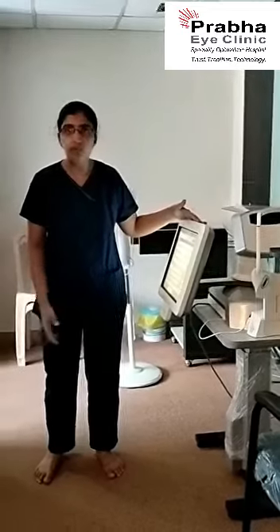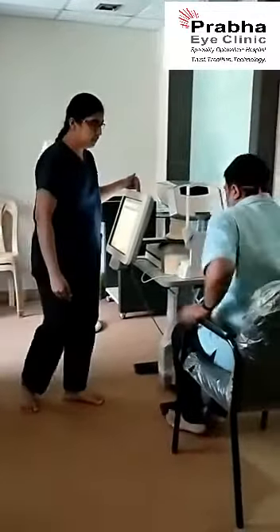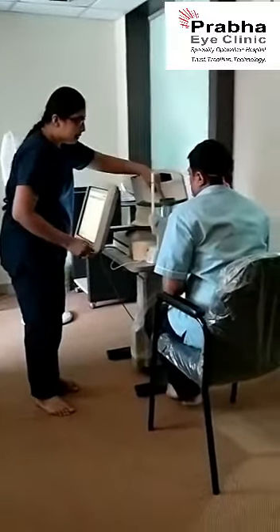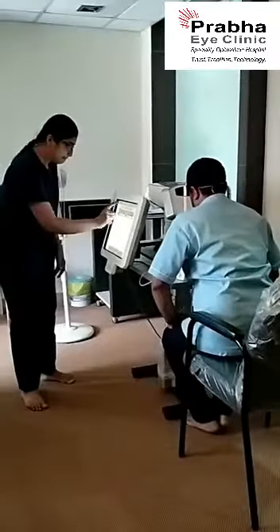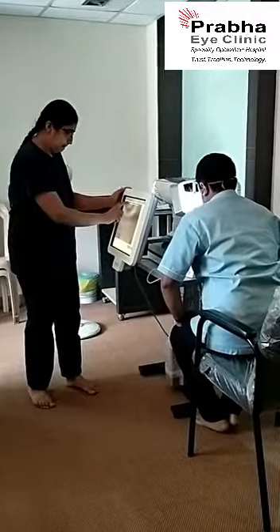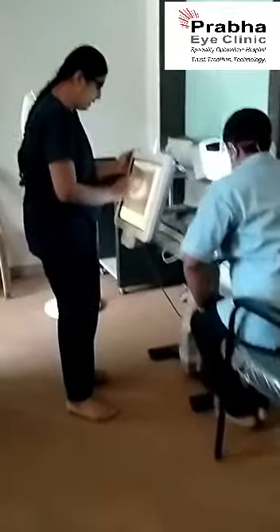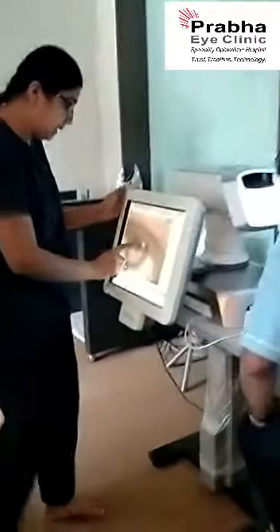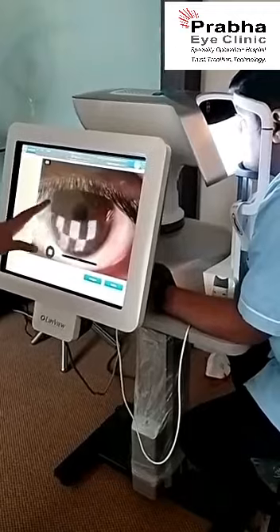We have Mr. Babu who will be our patient for this demonstration. In this equipment, we will be analyzing the lipid glands as well as the tear film.